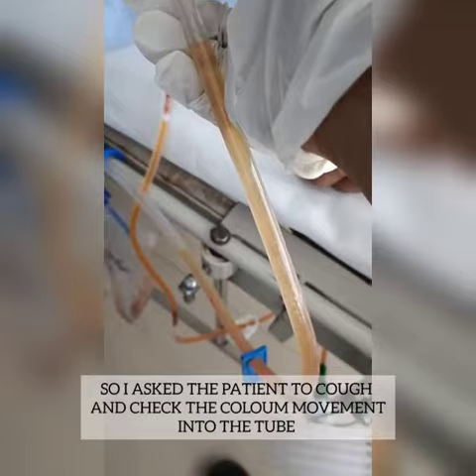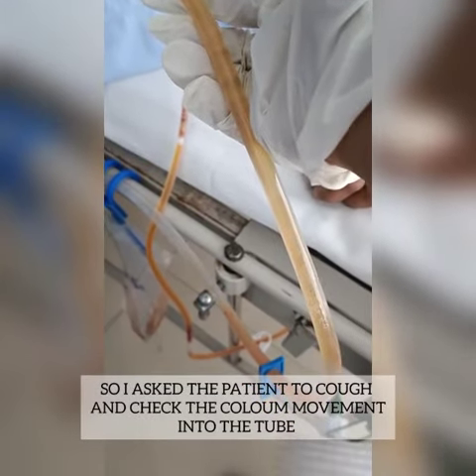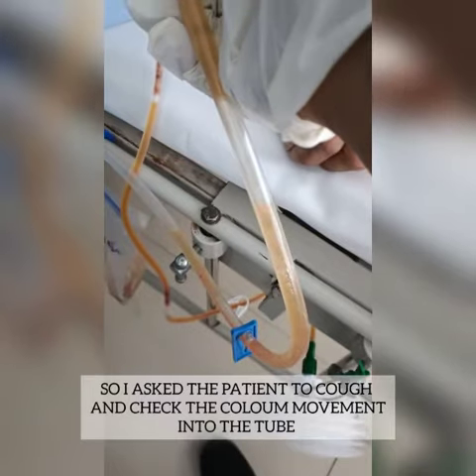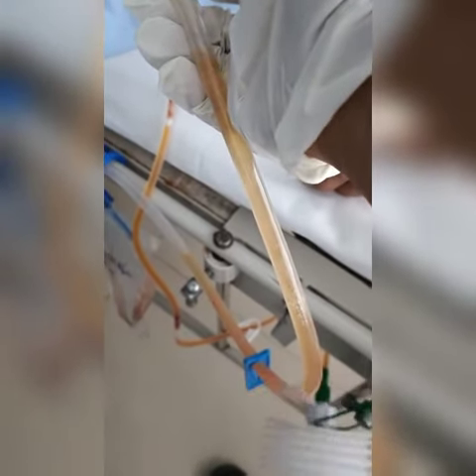So here I am going to check the ICD column movement. I just asked the patient to cough, and you can see that there is a presence of column movements.